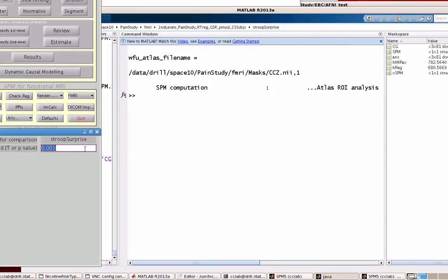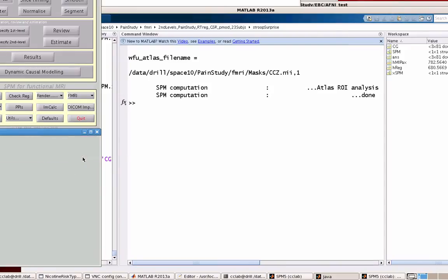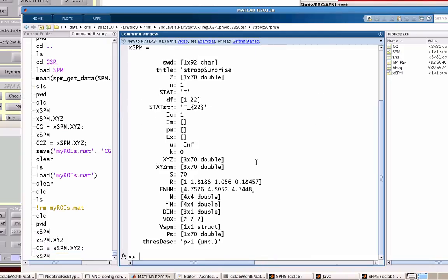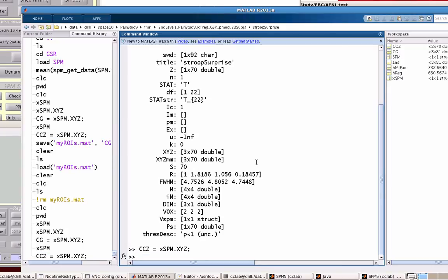So now I'm selecting CCZ, and again, p-value adjustment is going to be 1, 0 extent threshold. And again, XSPM gets updated. So now CCZ equals XSPM.xyz.